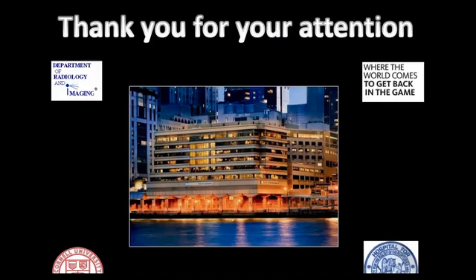Can epidural lipomatosis be a cause for radicular pain? I think epidural lipomatosis can contribute to spinal stenosis, because anything that compresses the thecal sac, and in some people with spinal stenosis, they will have a polyradiculopathy. Again, there's not a standard definition, but if you see fat that's uplifting the ligamentum flavum, and I don't have any pictures in this talk on that, then you can say there's epidural lipomatosis, but I don't think it affects the foramen as much.